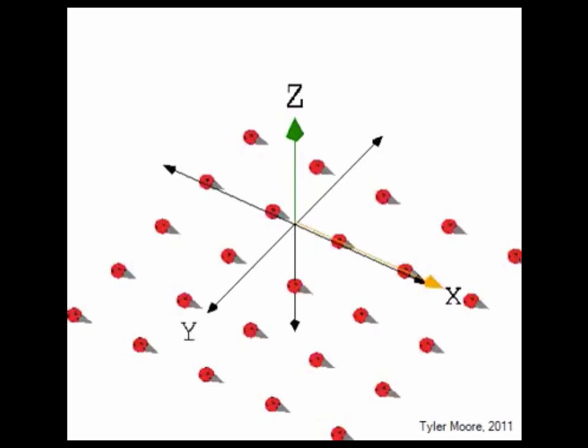And the signal that we see depends on these things doing the same thing together and producing a bigger effect. So if they suddenly start doing slightly different things, then the resultant, the addition, gets smaller and smaller over time. So what I want you to pay attention to in this movie is how long this yellow vector is versus how many of the little red circles with the gray arrows are pointing in the same direction.